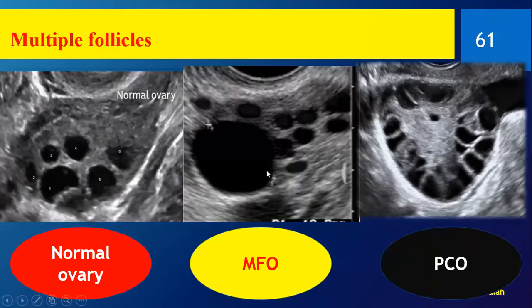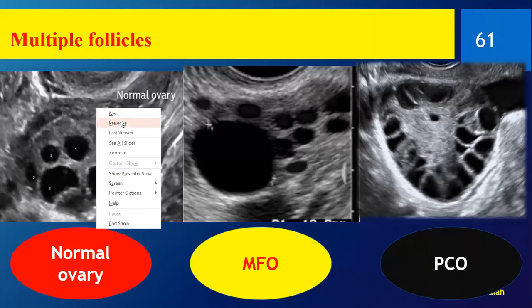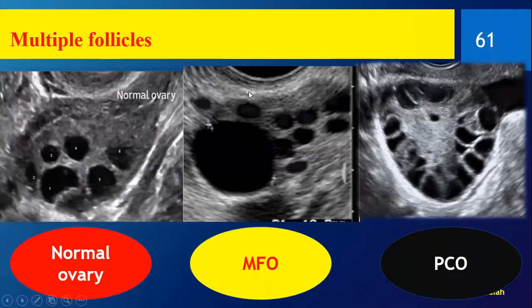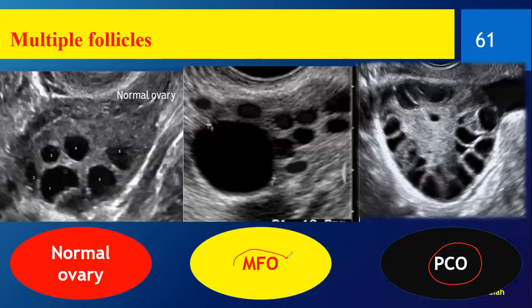Is this normal or multifollicular? The follicles are not so many and not arranged in the periphery or central — this is a normal ovary. Looking at all three side by side: in PCO the ovary is enlarged with many small follicles arranged in the periphery and an echogenic center. In multifollicular ovary there are many follicles but they are in the center and periphery, some are enlarged, and the ovary is not overly enlarged. In the normal ovary there are some follicles arranged normally.